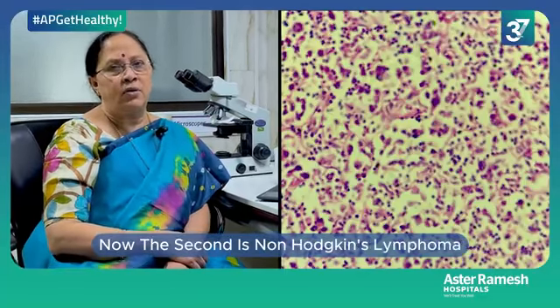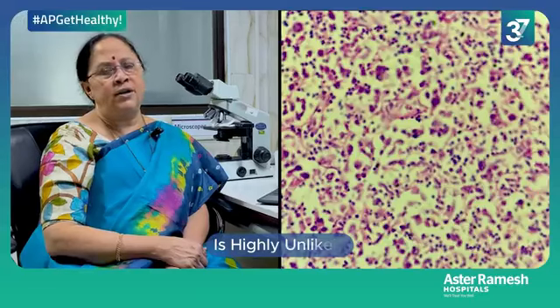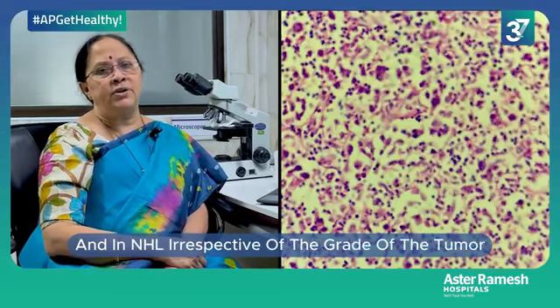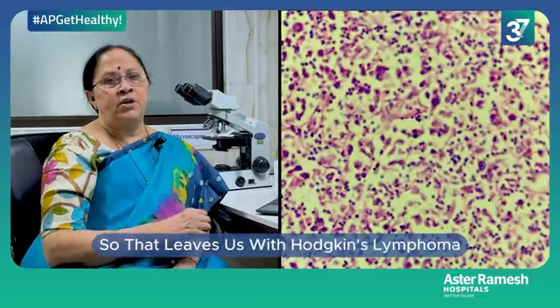Now, the second is non-Hodgkin's lymphoma. Non-Hodgkin's lymphoma with partial effacement of lymph node architecture is highly unlikely, and in NHL, irrespective of the grade of the tumor, you will see monotonous proliferation, not small cells and large cells. So that leaves us with Hodgkin's lymphoma.